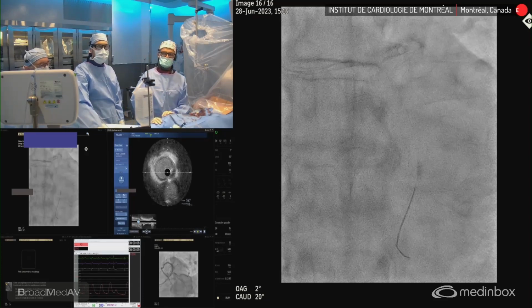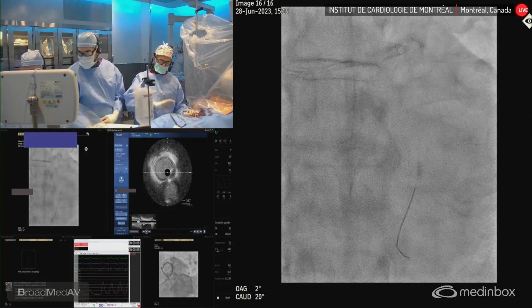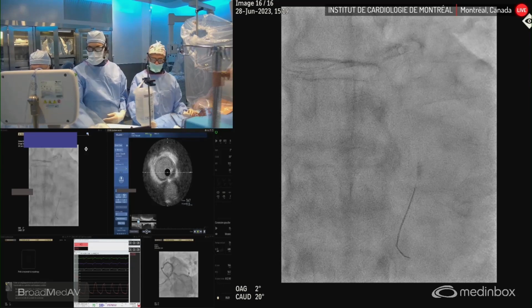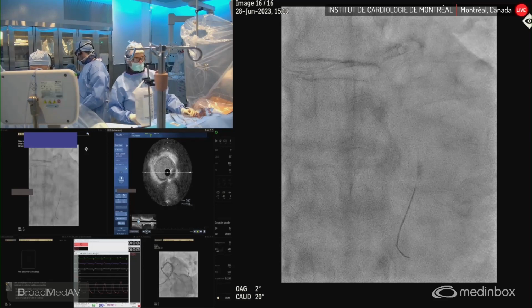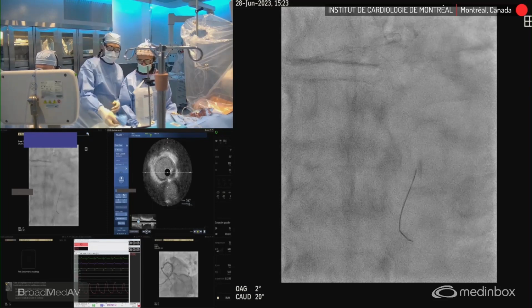So at the same time, it's a mixed combination now of lithotripsy and orbital atherectomy in the circumflex. I think so. So we know that orbital atherectomy is not good for very eccentric calcium or short calcium lesions. Orbital atherectomy is very good when you want to polish the vessel, to sand basically the calcium off the edge of the vessel that's not eccentric, that's ideally long. It tends to improve the vessel compliance, and it's also potentially safer than rotablation in this case because of the tortuosity. Although severe tortuosity is a contraindication also for orbital atherectomy.